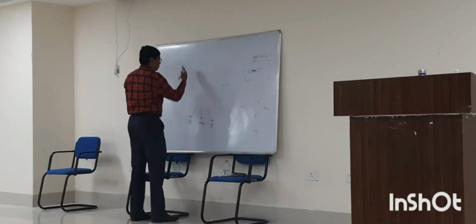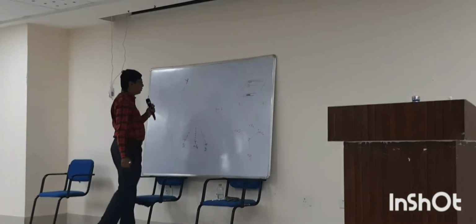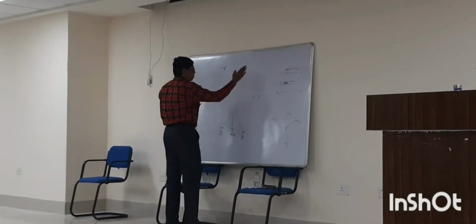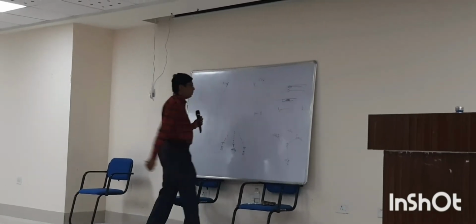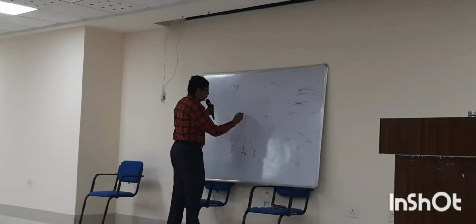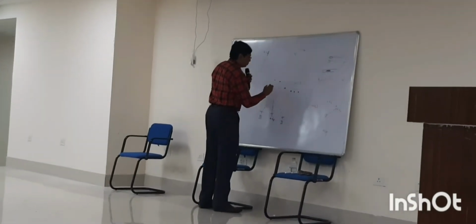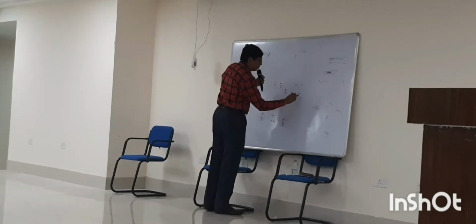AVR, AVL, now the chest leads. V1, V2, V3, V4, V5, V6.